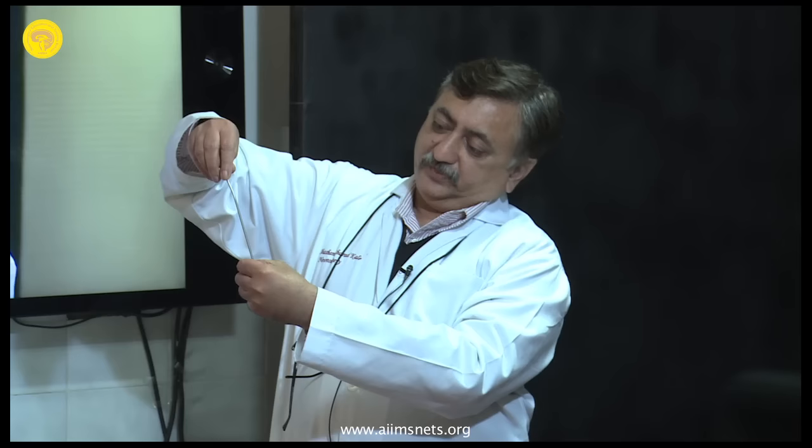As long as you have taken care of the pleura, because the pleura is attached here like this. So as long as the pleura is taken care of, and that's very easy, take a malleable retractor, place it here like this beyond the transverse process, and you're clean. And then you're in, out, in, into the body, away from the pedicle, away from the medial spinal canal, very safe. So whenever there is a doubt, use the in-out-in. You will be in the body, you will engage the bony cortex in the transverse process and some part of the pedicle, and it will be safe. That's a very simple way of doing thoracic pedicle screws. But thoracic pedicles, you don't really need them, very, very rarely.